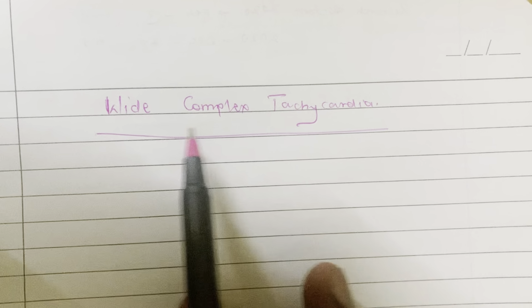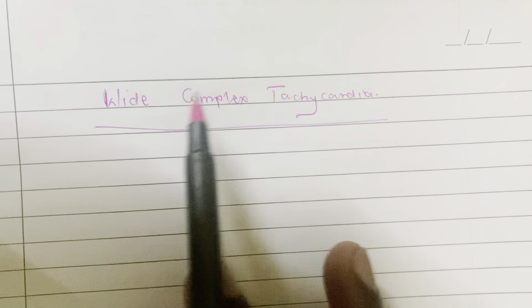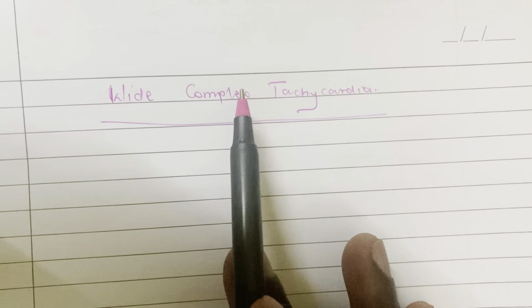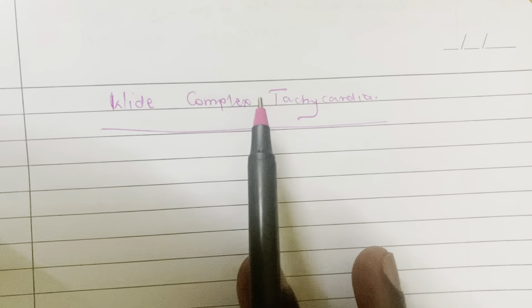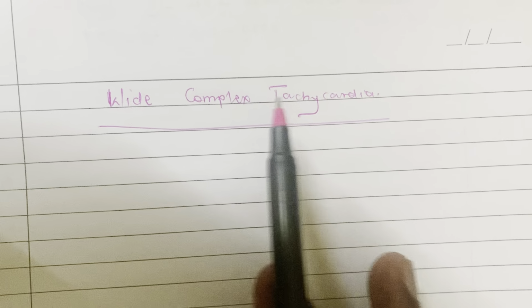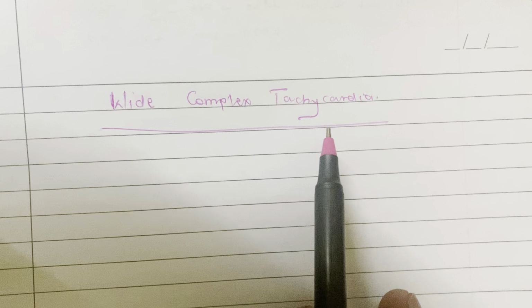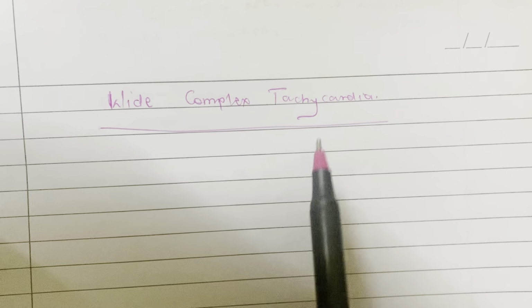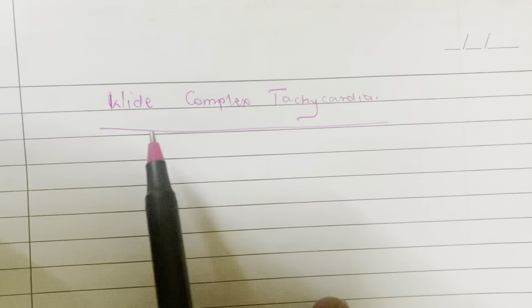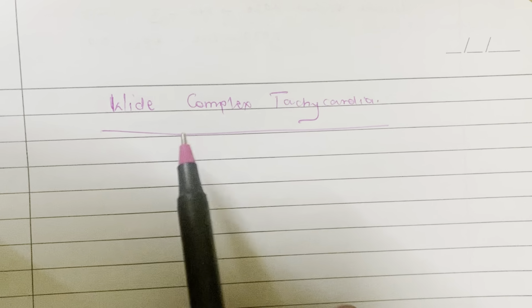The first one was the narrow complex, and we saw all the differentials of narrow complex tachycardia, including atrial fibrillation, atrial flutter, sinus tachycardia, supraventricular tachycardia, that is paroxysmal. So all those ones we saw. Atrial tachycardia we saw, but we said the most important are sinus tachycardia, very common; atrial fibrillation, because of its risk of forming blood clots; and then atrial flutter, because it can easily convert to atrial fibrillation.